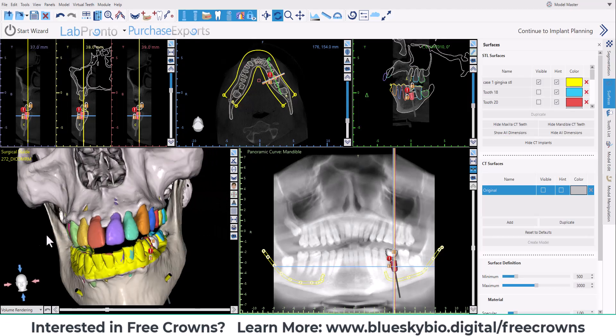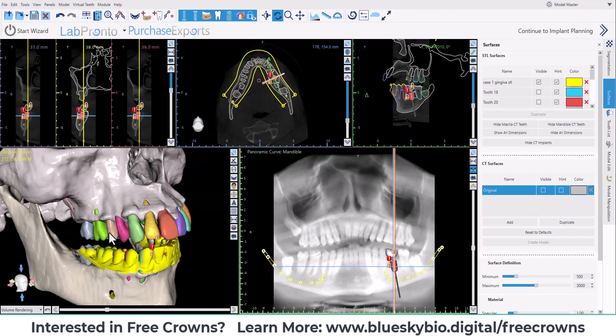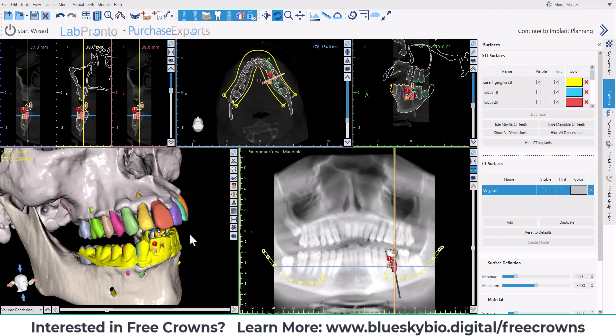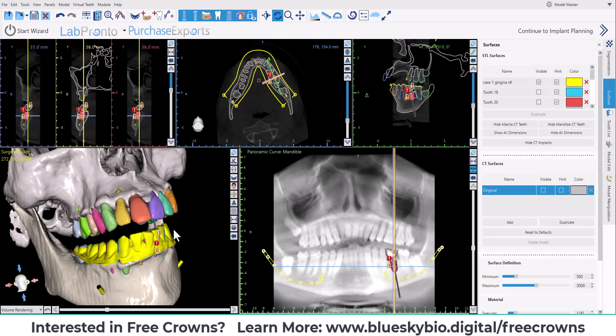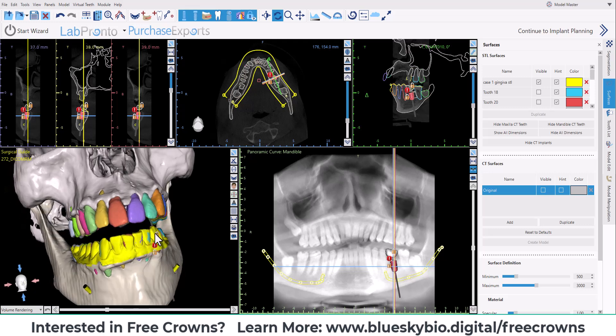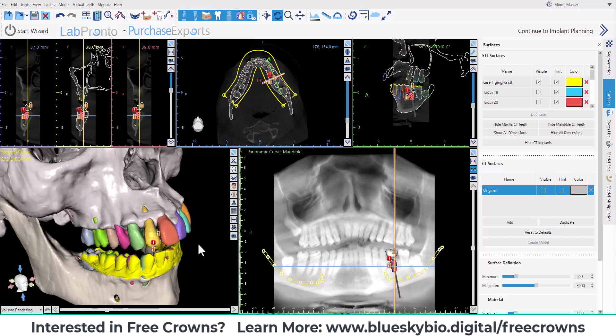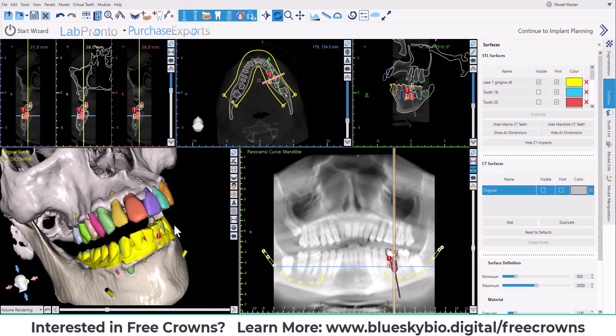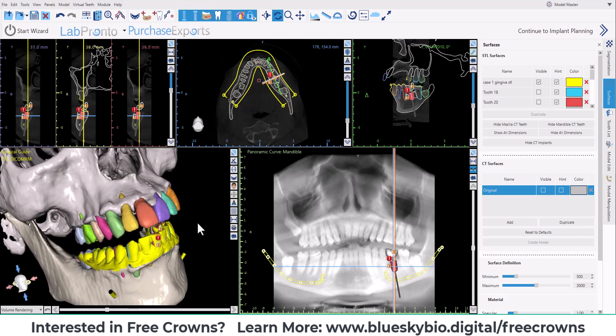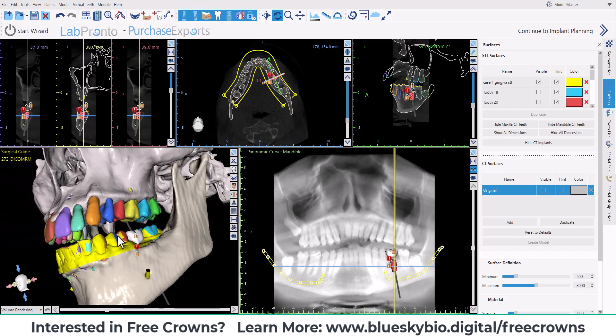BlueSkyPlan now contains the ability to delete teeth from the STL file from the optical scan with a single click. I will demonstrate this functionality in this tutorial video.